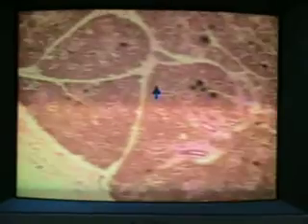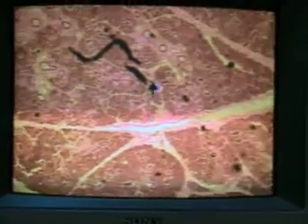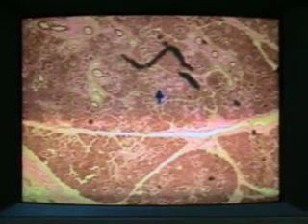There are different kinds of cell types that you see in there, and remember, this is a mixed gland, so it has both acinous or serous secreting material as well as mucin secreting cells. That's one of the things you want to look at: can I find an area that I'm sure has both cell types in there? So let's go, this is one that will have it.